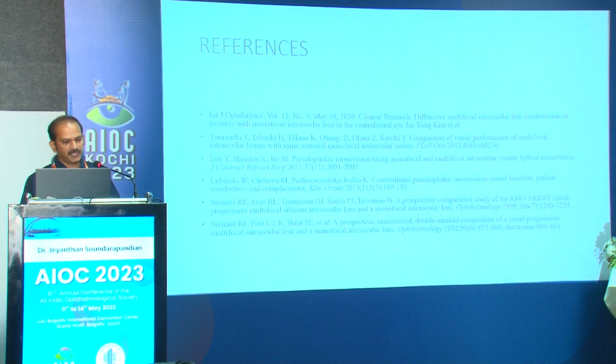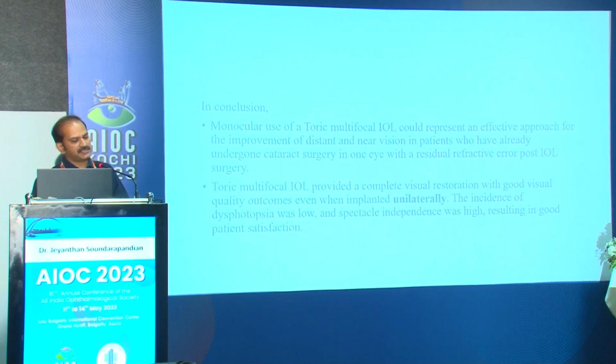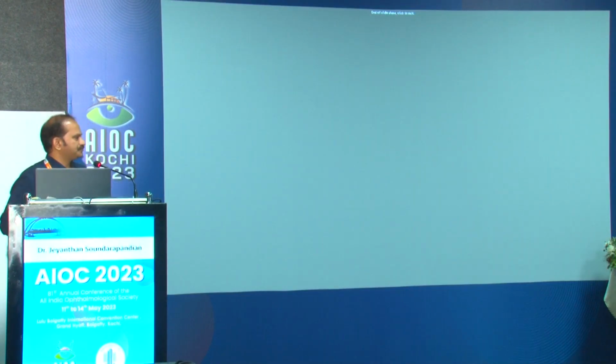of their activity. So to conclude, toric multifocal IOL provided a complete visual restoration with a good visual outcome. Even when implanted unilaterally, the incidence of dysphotopsia was low, spectacle independence was high, resulting in good patient satisfaction. Thank you.